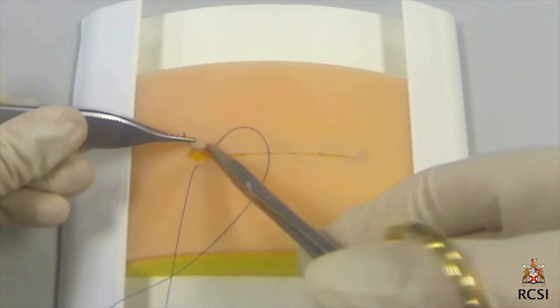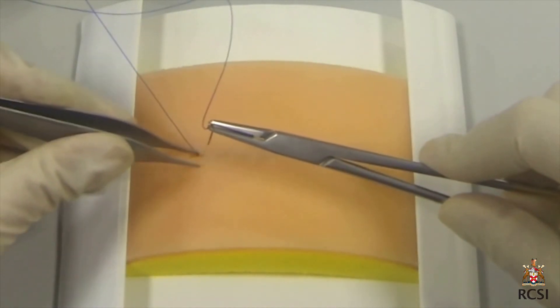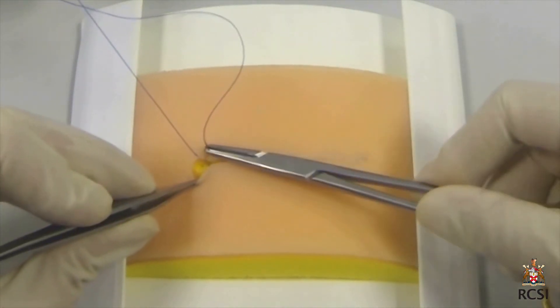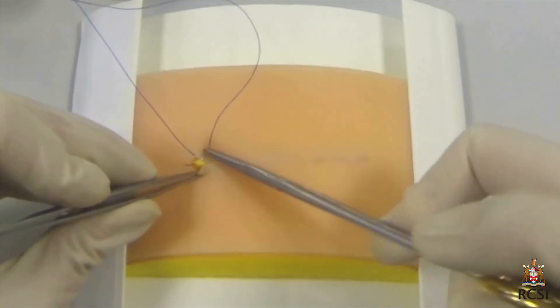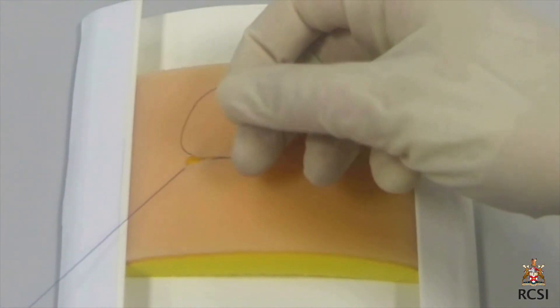Once the end of the wound is reached, tension is placed on the suture away from the wound to pull the skin edges together. On this occasion we are going to finish the suture with an Aberdeen knot. A deep bite is taken in the wound. When pulling the suture out of the wound it is not pulled out fully. A loop is then left at the end.